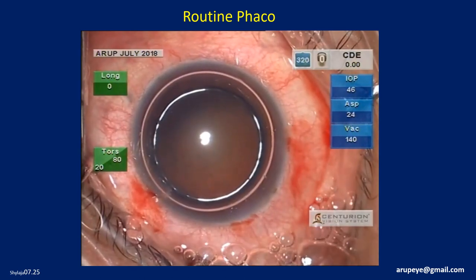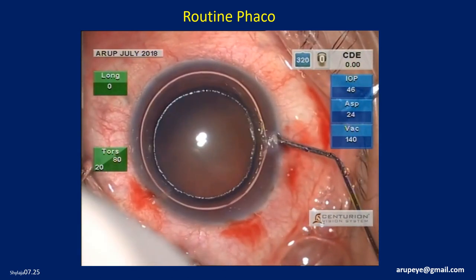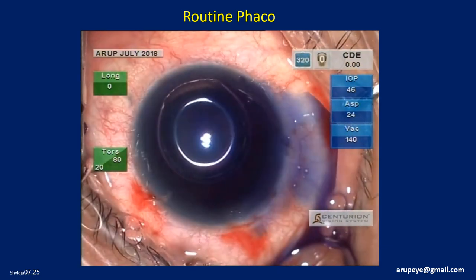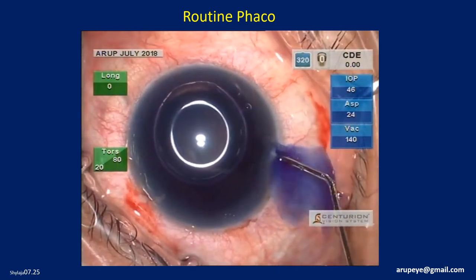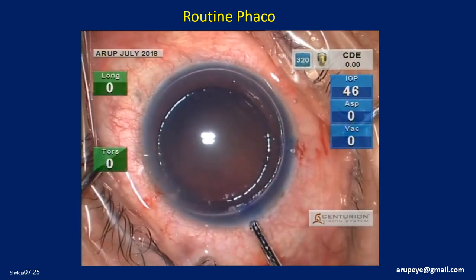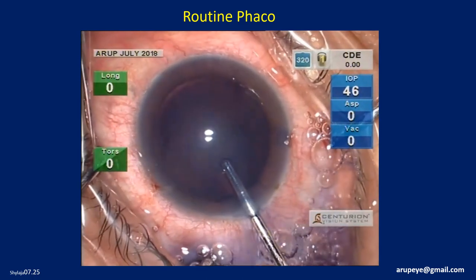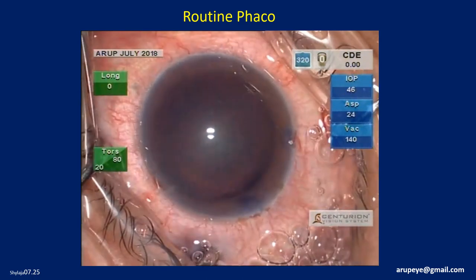The anterior capsule is stained with trypan blue dye under an air bubble. This technique using an air bubble results in adequate staining of the anterior capsule. The air bubble and the excess stain are then removed from the anterior chamber.